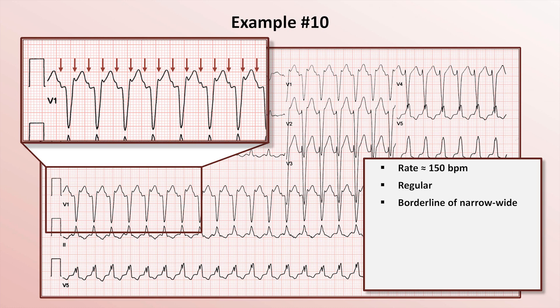But with experience, you'll realize that those bumps superimposed on the beginning of the ST segment are the exact same ones superimposed on the end of the T-wave. Thus, there is regular atrial activity occurring at a rate of about 300 beats per minute.